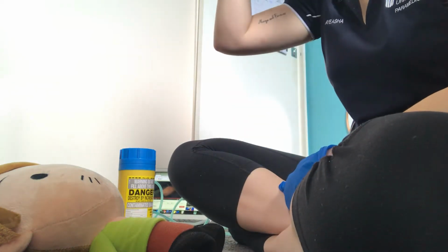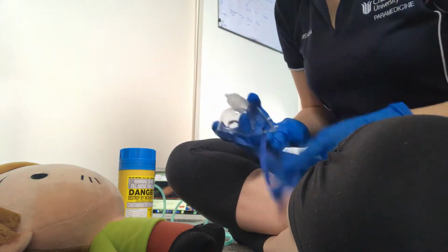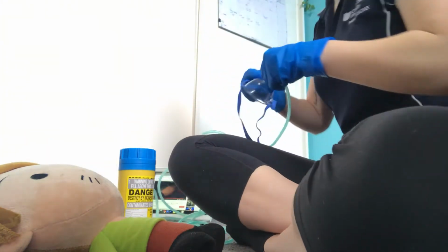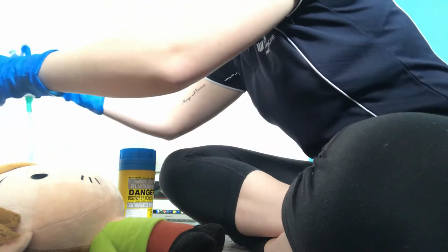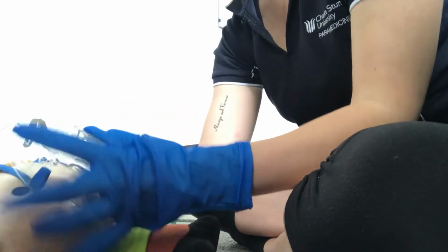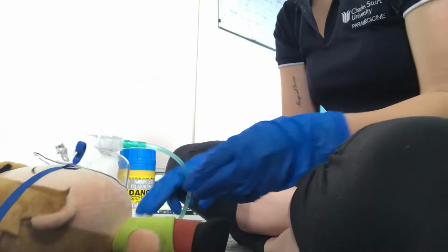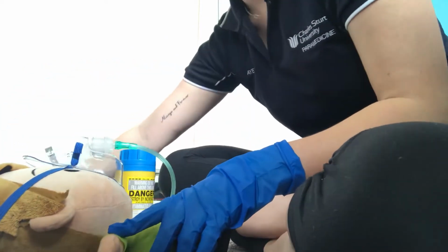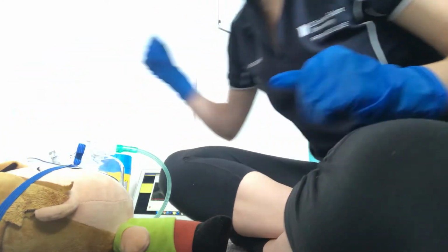So to prepare the patient, we're going to make sure that the patient is on high flow oxygen, which if a trauma situation would be on anyway. So we're just going to get our mask ready. And when the patient is unconscious, we're still just going to explain what's going on for him. There we go. So patient is on high flow oxygen. We're going to attach it to the oxygen.